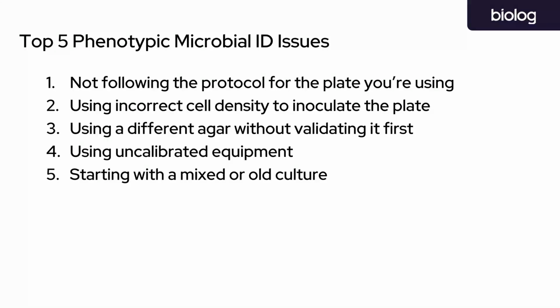Yeah, the easiest way to determine if you have a mixed culture is if you have different morphologies. The Biolog plates are not able to handle mixed cultures and get a successful identity. That's because with mixed cultures, you're getting the composite metabolic output of both of those cultures in the Gen 3 plate, for example, and the algorithm is just not able to parse that complex of data. So it's really important to make sure that your strains are purified.